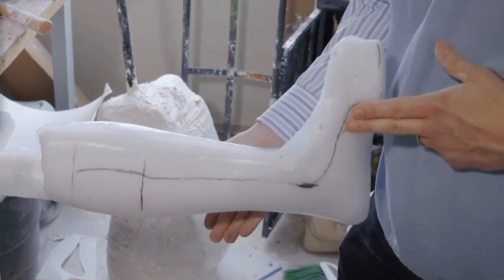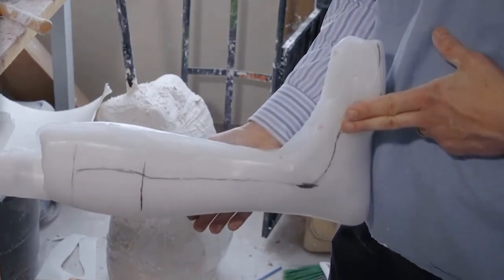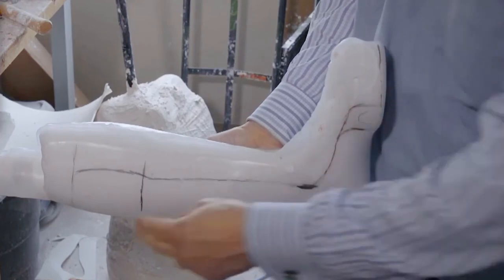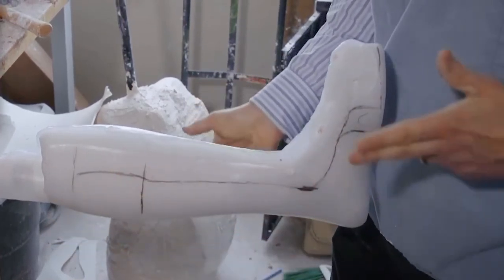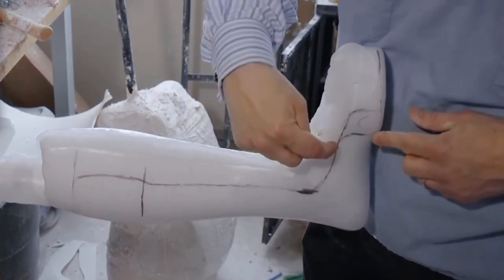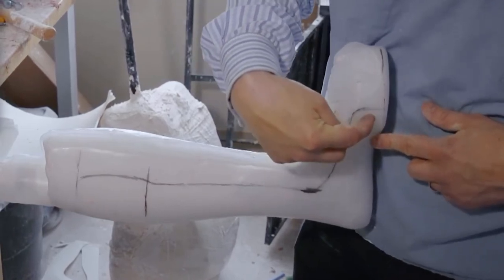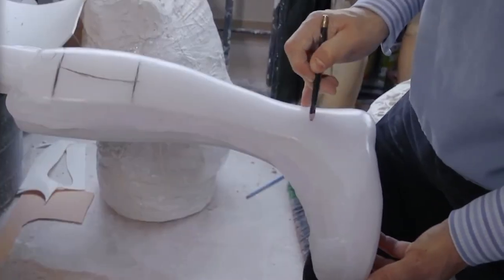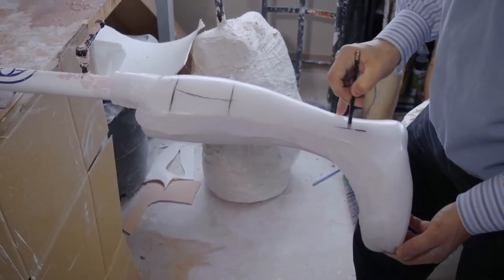And then we would need something on the other side to help keep it straight. The two opposing forces right there would help to do that for the patient. And then there can be another three-point pressure system up here. But these two points right here are very important. This is a medial forefoot extension when it comes past the first metatarsal phalangeal joint here. We're in front of the ankle bone here. This is the solid ankle again. Okay, so we're going to come up like this.